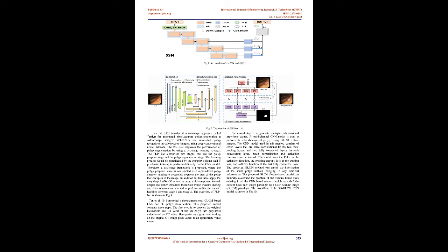A CNN model is first trained to detect and segment polyps in each video frame. Once a polyp is detected, the center of the polyp is computed and traced through the following frames until stopping criteria are met. During tracing, optical flow is utilized to trace easier cases and the CNN is used to process harder ones. If a frame doesn't contain any polyp center seed, the frame will be regarded as a negative frame. If there are multiple polyp seeds in a frame, a spatial voting algorithm is run and the most confident center is kept as the detection while others are eliminated. The overview of the proposed method is shown in Fig.6.